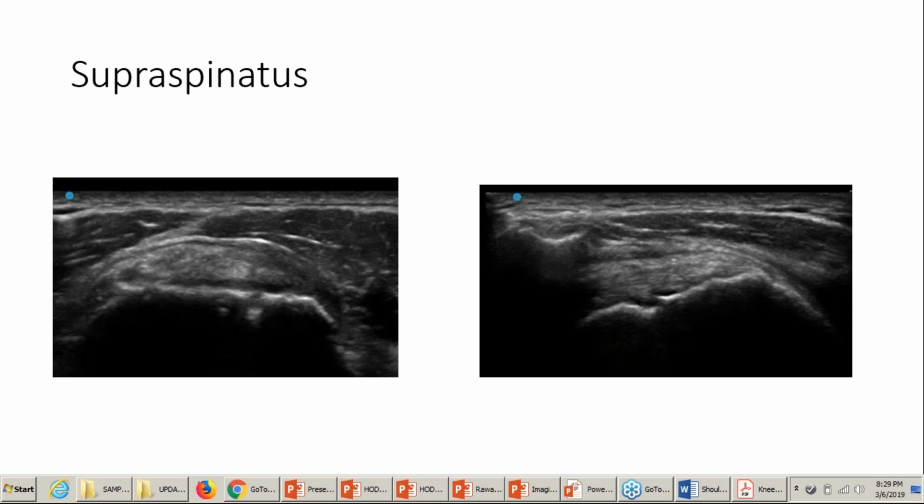Do you describe the chronicity, do you say it's a subacute or acute or chronic condition? We don't try to get too much into it because there is also some age progression. So you have to put everything together: the clinical picture, what's the age of the patient, what's the mechanism of injury, because some people have chronic wear and tear degenerative changes, but they can re-injure something. So there is some degeneration in this tendon, but you'll have to see more than this to comment on that. We don't really define acute, subacute, chronic like we do in EMG. You can broadly say it's more chronic or more acute, but we look at other indirect signs.